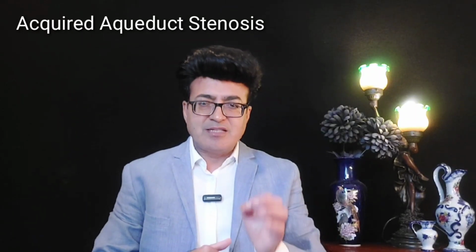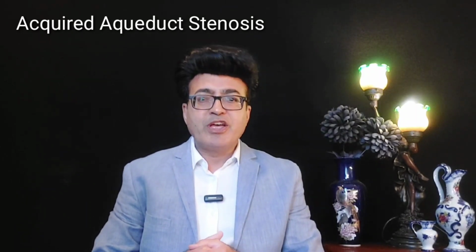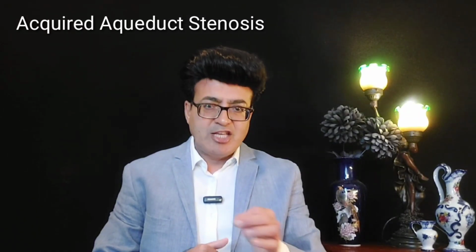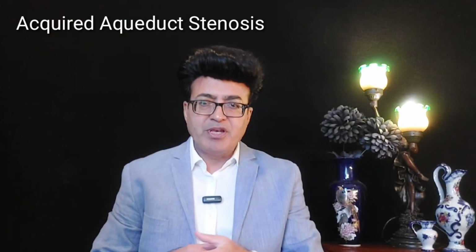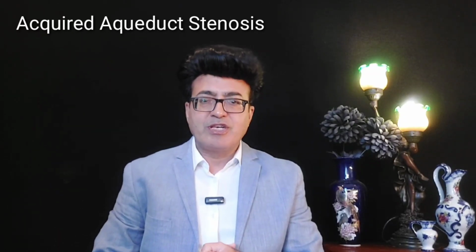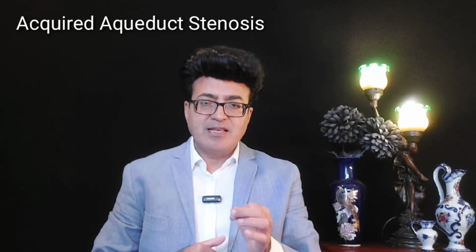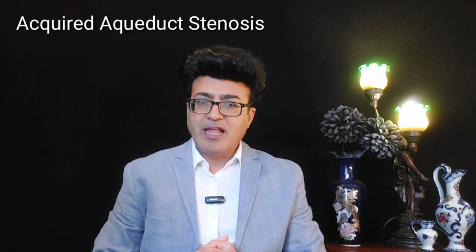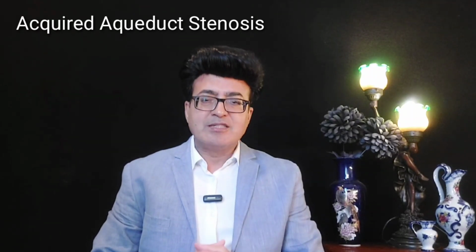There is a very characteristic example of the acquired narrowing of the cerebral aqueduct at the age of 14 years, and the child presented with headache, confusion, nausea, vomiting, and all the other symptoms related to increased intracranial pressure. We did the CT imaging and we found that this is the confirmed classical diagnosis of cerebral aqueduct stenosis. So let's see this video.